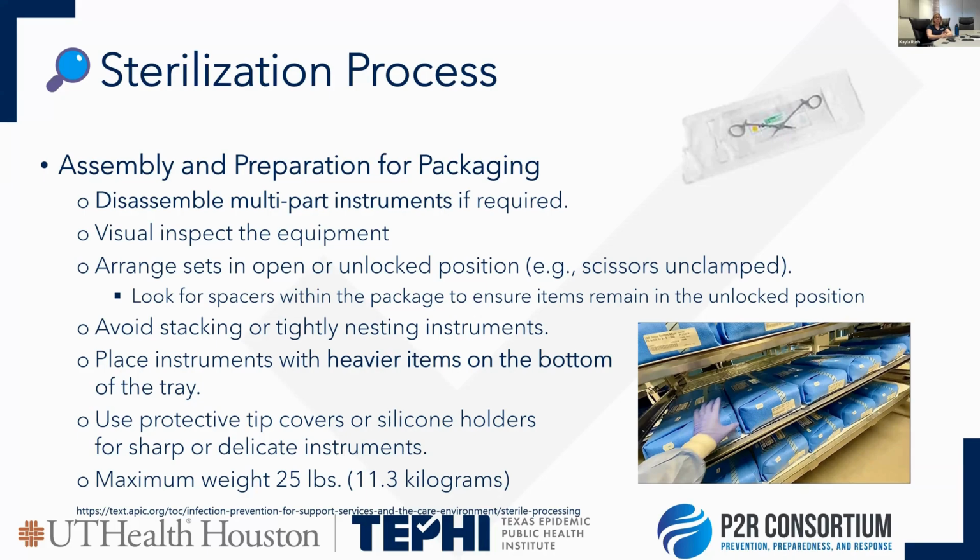Anything that has a hinge needs to be completely open. So scissors, any type of equipment that has a hinged device of whatever you're looking at needs to be open, because if it's not open, when you place it in the sterilizer, you're not having the steam or the chemicals that you're using fully cover that surface area. So if it's closed and it's blocking, so it's two pieces on top of it, that sterilant that you're using in the sterilization isn't getting into that surface, and it can have areas of opportunities where bacteria is still there and it's not being cleaned.